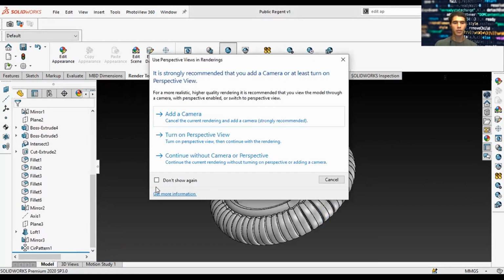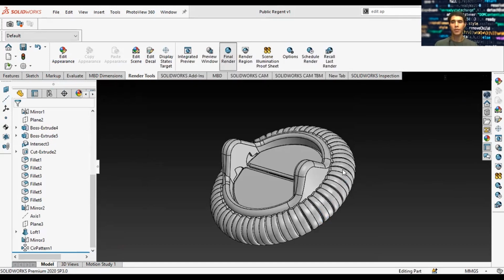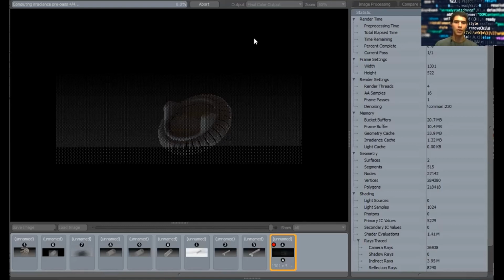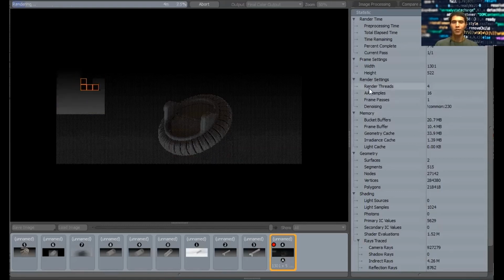It asks if you want to add a camera. So we'll continue on without this for now. But let's say you want to add a certain angle within the shape besides the one you currently have. You can add a camera perspective. So we'll let this render, and we'll be back when it's done.